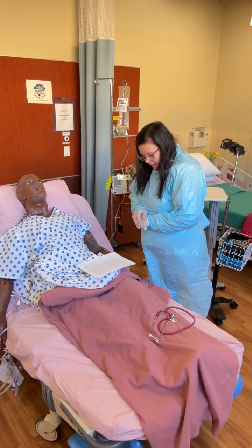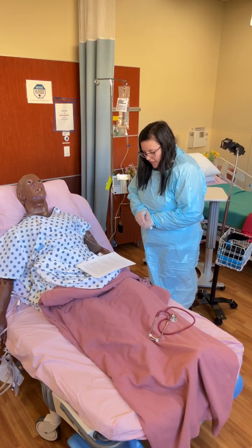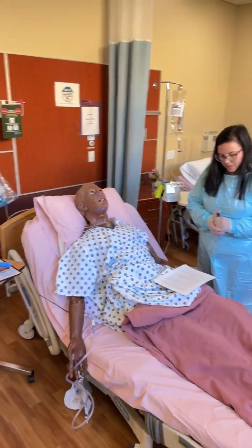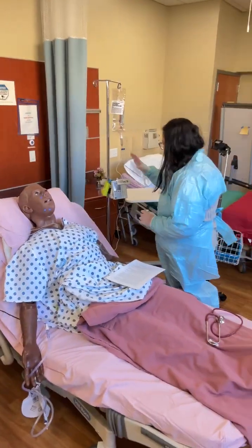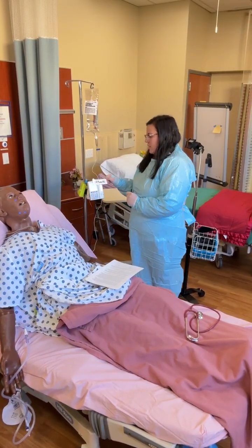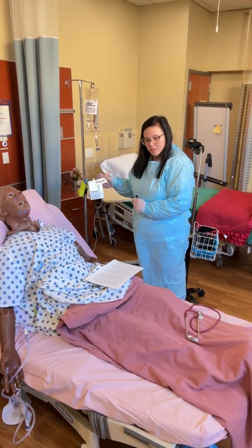You are going to spike the IV bag. You're going to hook up the tubing just like you did in skills. The only thing that we do not do in the sim lab is turn the IV pump on. So you don't have to worry about plugging it in or turning it on. The only thing that you need to do for rates is worry about the sticker here.